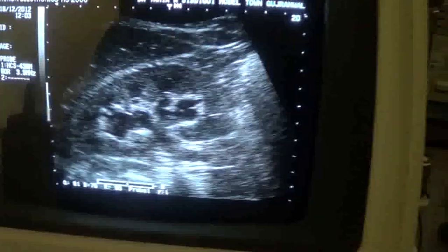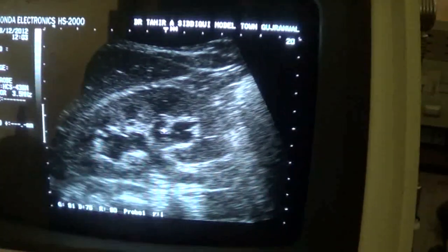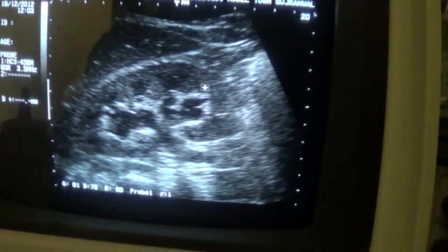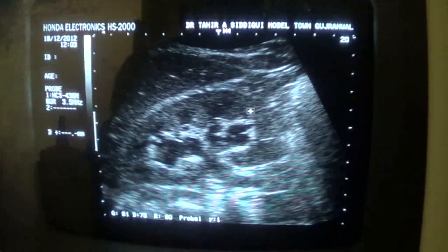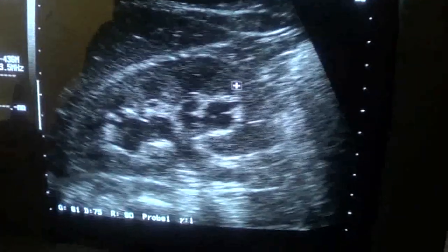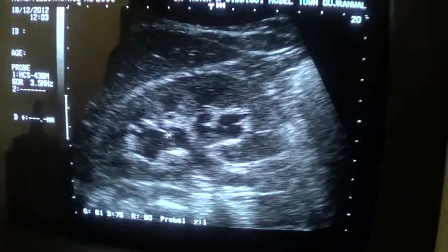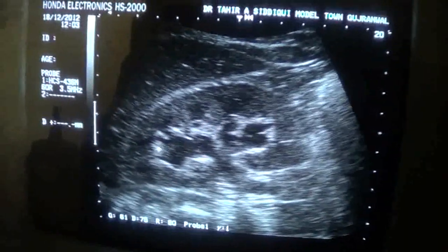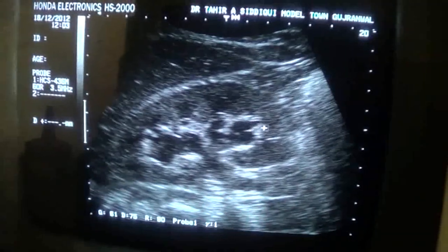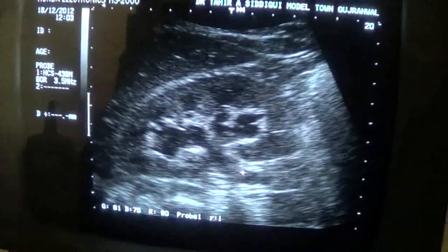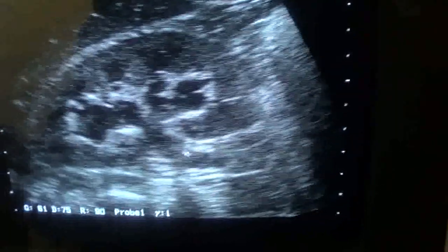The image in front of you is that of the right kidney. The purpose of this video is to make you understand that these are the dilated calyces in the center of the kidney — upper pole, mid-region, lower pole — and this is the dilated proximal ureter, this area.